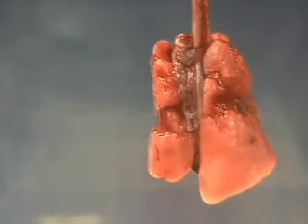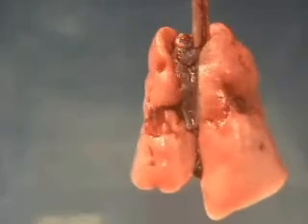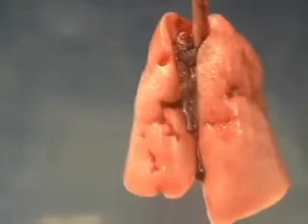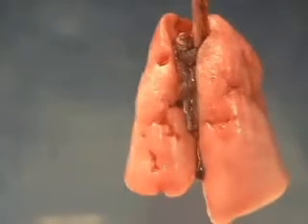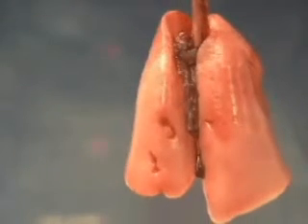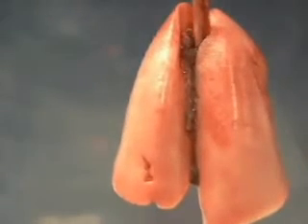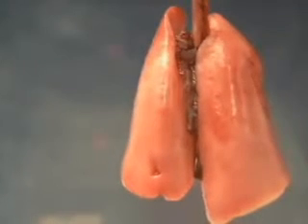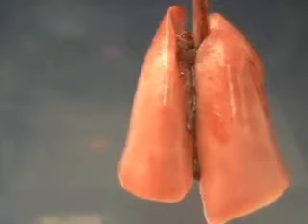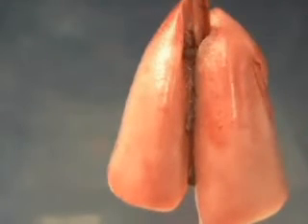The PEEP level is increased to a pressure of 15 centimeters of water, and the collapsed lung is starting to inflate, a process called recruitment. The lungs are more homogeneously inflated with each breath. The areas of atelectasis are disappearing with each breath. At the end, the lungs are completely inflated, and the inflation is homogeneous.